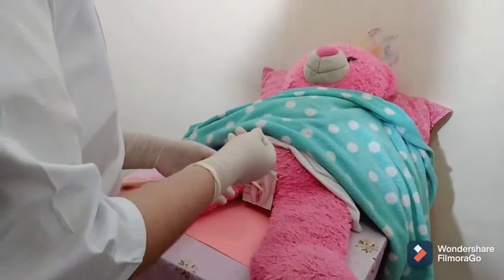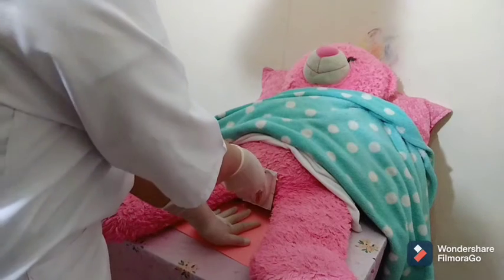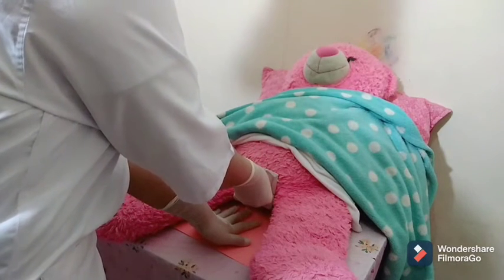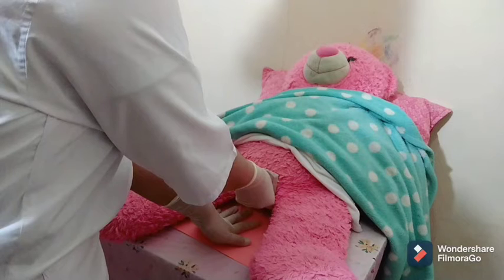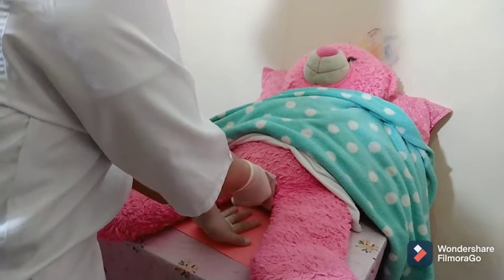Hold the absorbent towel in your non-dominant hand in front of the perineum. Pinch the catheter near the meatus with your dominant hand and pull it steadily out onto the absorbent towel until it is retrieved. Hold the catheter at an upward angle to the drainage tubing so that any urine will be drained into the drainage bag.